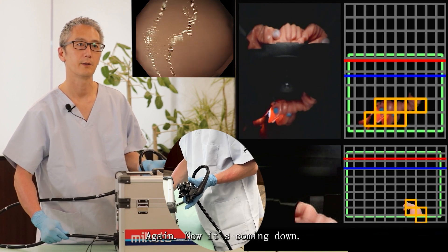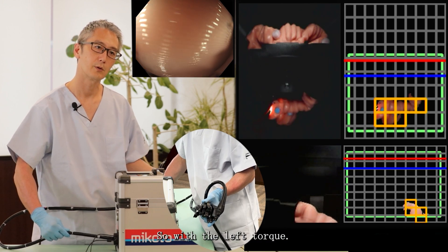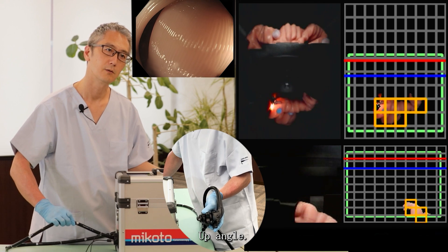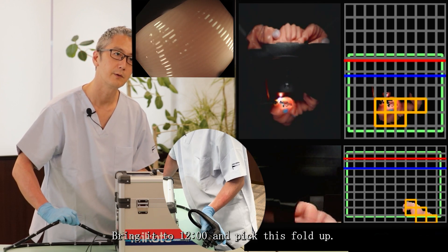Again, now it's easy coming down — with left torque, up angle. Bring it to 12 o'clock and pick this fold up.